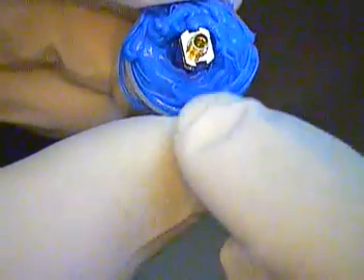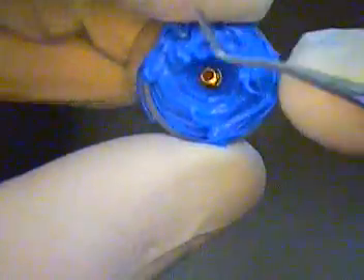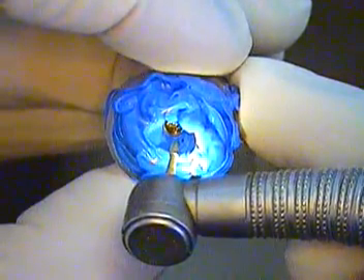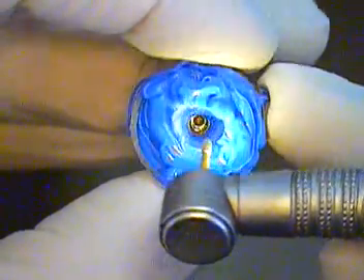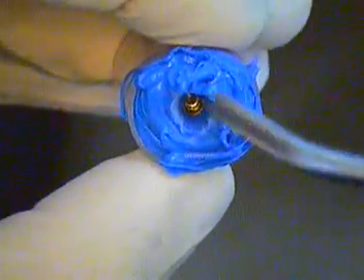I'm going to carve a little bit on this lingual, so I'll need to back this out and just carve that a little bit. Let me have a hollenback, please. Actually, what I'll do is just take a handpiece and a bur and trim that a little bit. There we go — that's the cingulum area. I'm just trimming that back a little, giving a little more depth so we can see. We're going to spray air in there and get all that out.